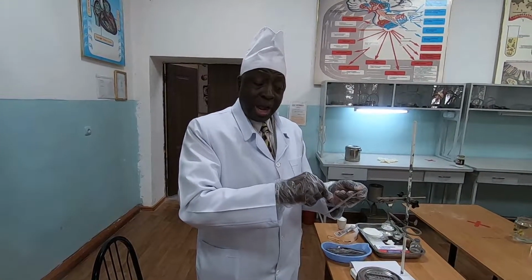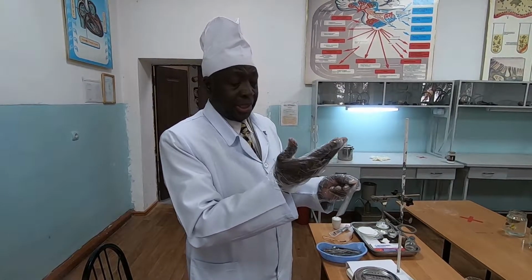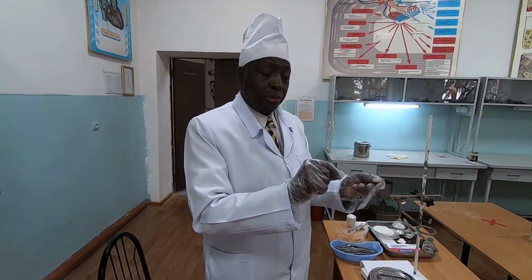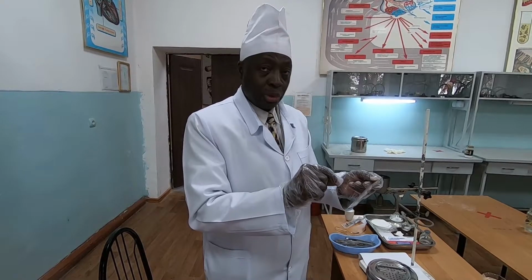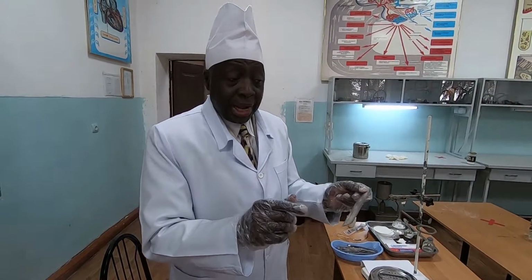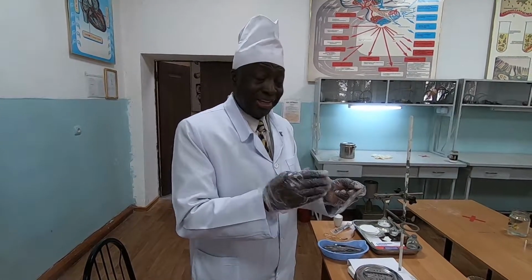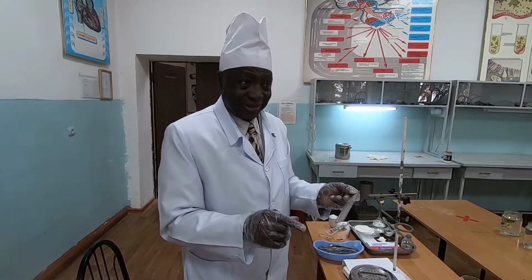adrenaline on one of the eyes and put it under light. Okay, under light, and the other one we add what we call solution of Ringer, right? And then after some few minutes we'll determine the effect of Ringer and the effect of adrenaline, and then we measure it, we see the difference. Is that okay? Thank you.